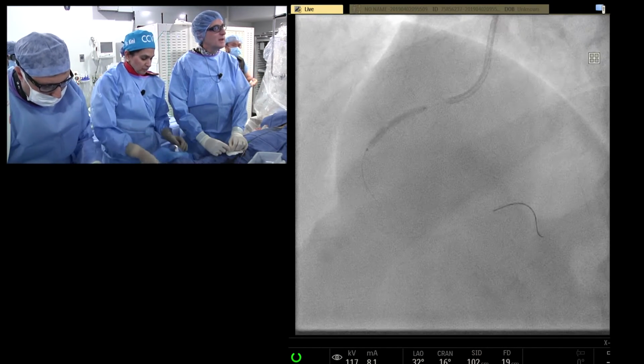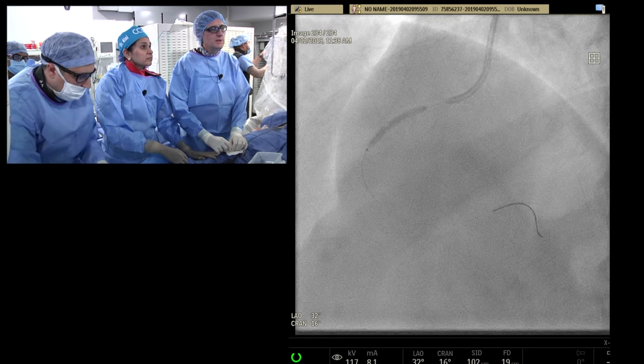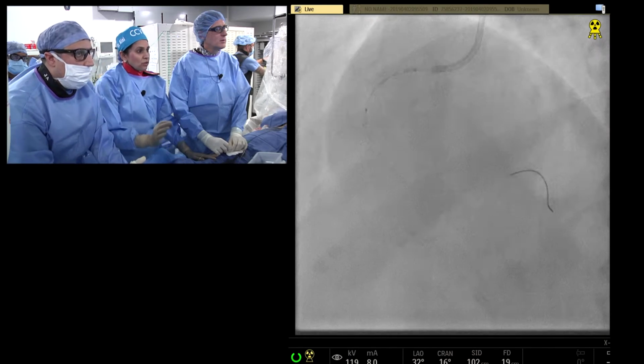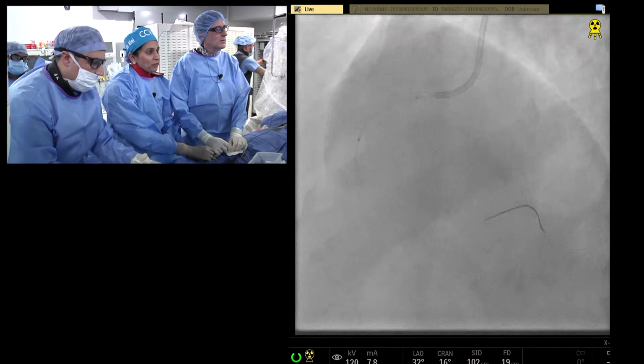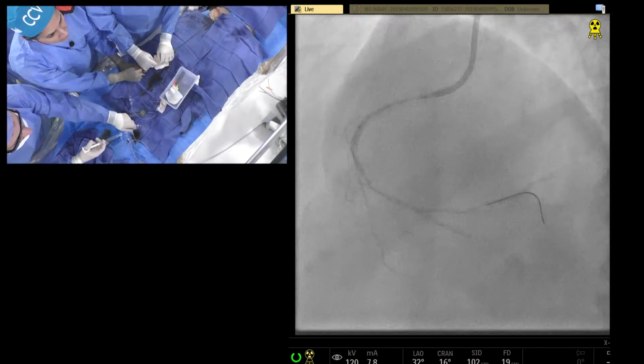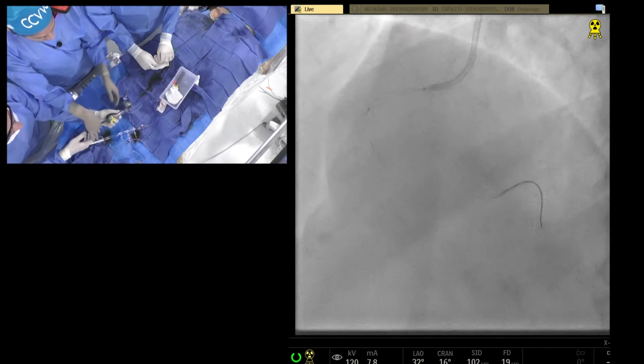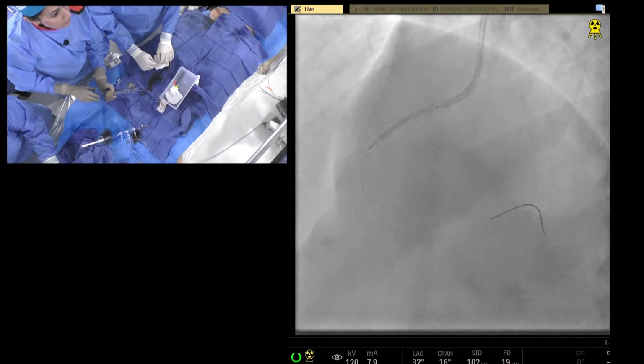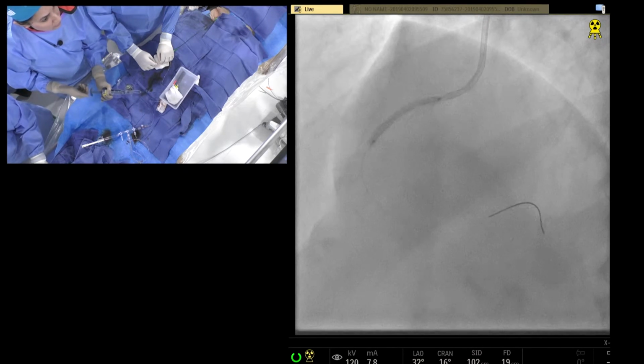Instead, she saw a fibrocalcific vessel in which she can use interesting technology to still break the plaque. It's strong enough to break the plaque and still be able to get a very good result with the stent. Does that make sense to everybody now, why she did this?